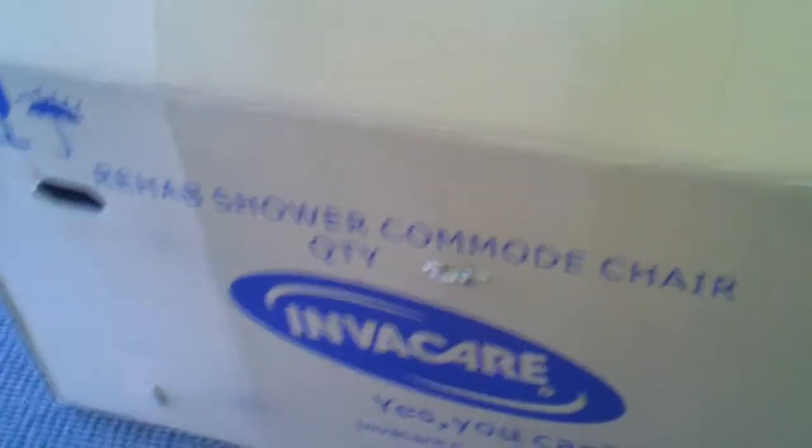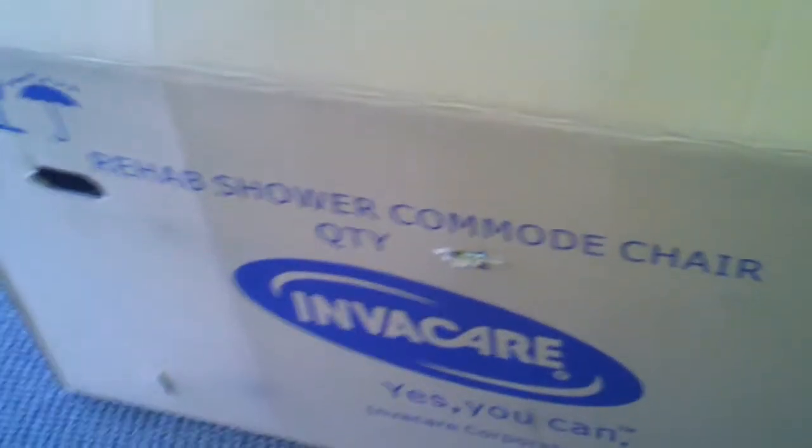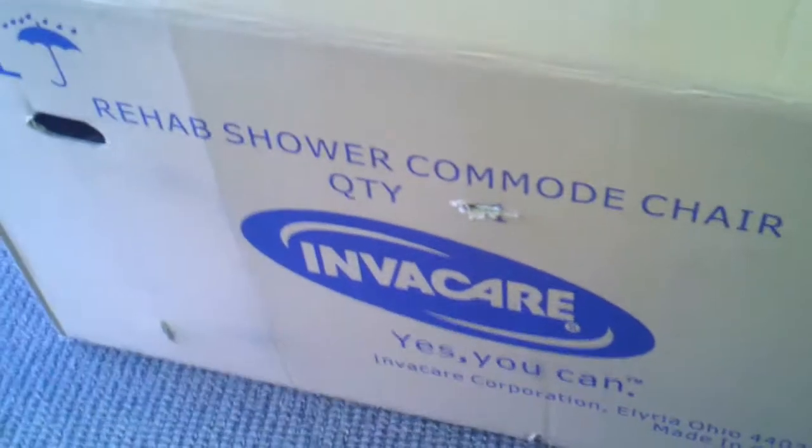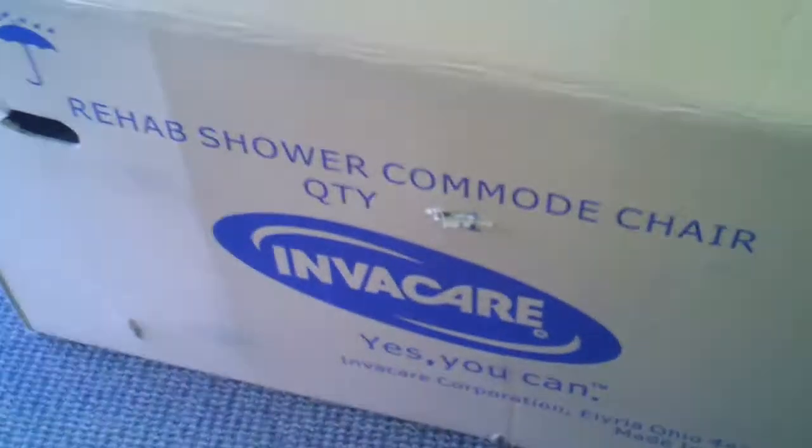Hello, you are looking at the Rehab Shower Commode Chair by Invacare. It's actually called the Mariner, and this is how it's shipped.